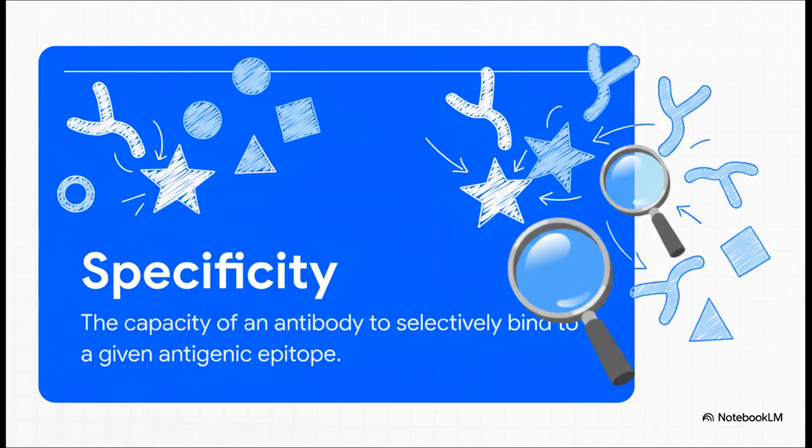And this gets us to the heart of the matter: specificity. For this to work, the antibody has to be like a molecular bloodhound. It has to hunt down its one specific protein target in a sea of thousands of other molecules and bind only to that one. If it latches onto the wrong thing, the result isn't just inaccurate, it's completely meaningless.